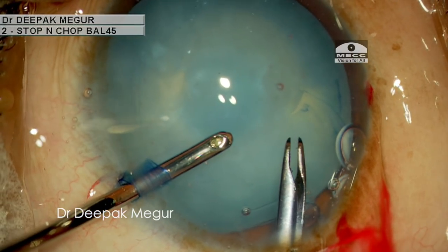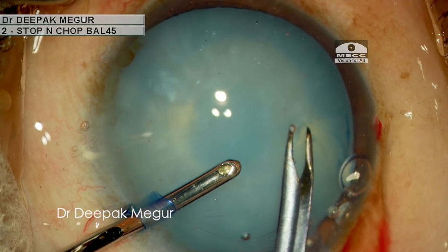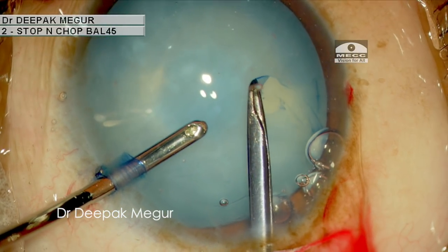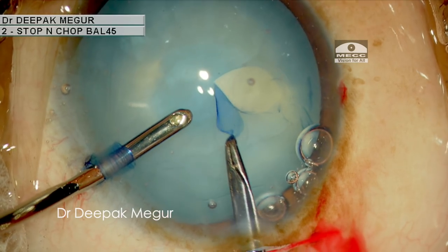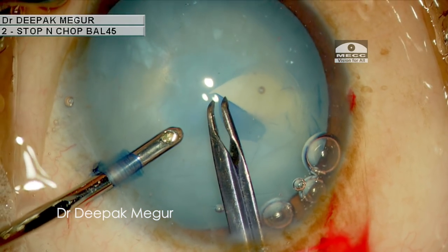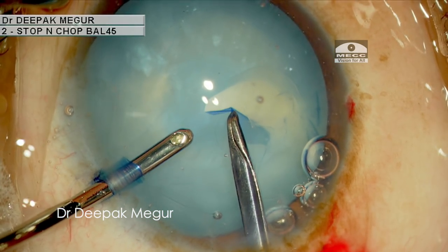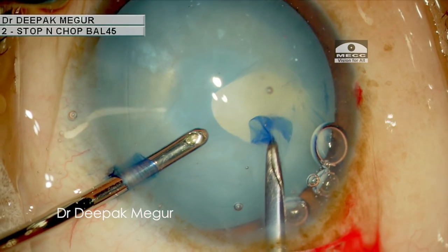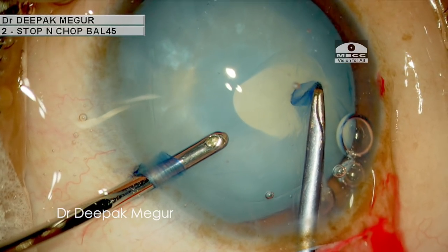I use the forceps to catch one of the flaps at the side of the puncture. My aim is to perform an initial small rhexis. My goal is to ensure that the flap overlaps the site of the puncture and then extend it later. It was important to rotate the flap gently, go beyond the area of the puncture, and ensure it is included under the tearing flap. Once this could be managed, I knew I was in the safe zone.